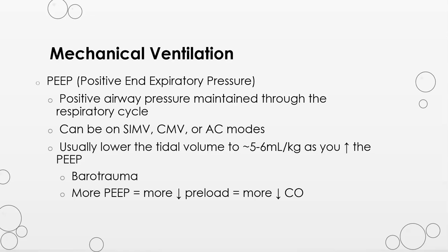As stated previously, increasing the PEEP decreases preload and can compromise the cardiac output. PEEP is usually set anywhere from 3 to 10 centimeters of water pressure.